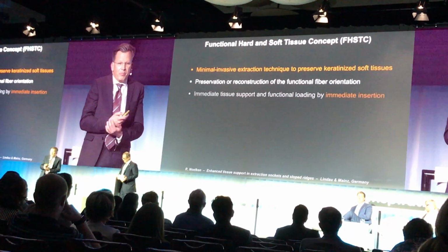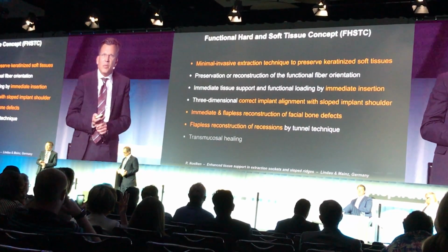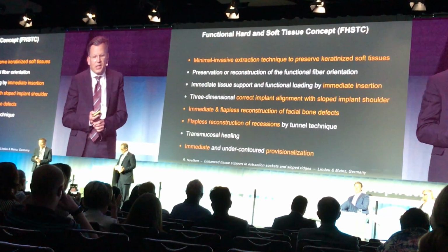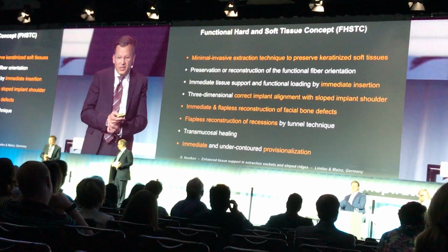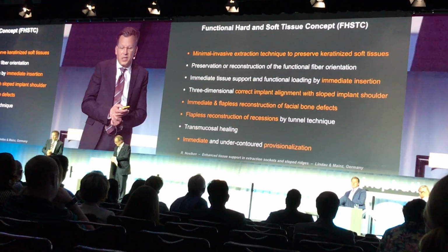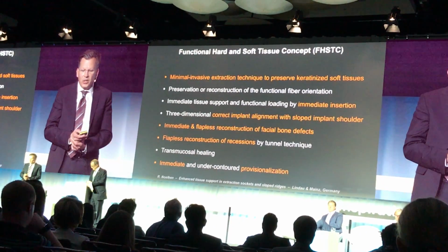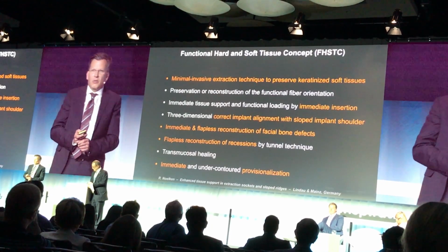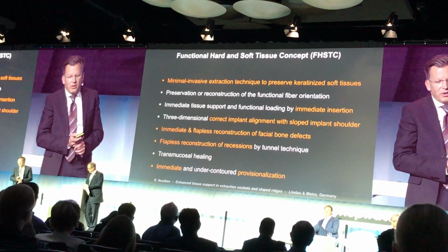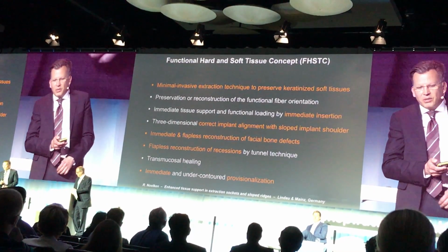The concept, what you have seen in the last 20 minutes, is based on minimal invasive extraction, the reconstruction of the functional fiber orientation, the immediate insertion of an implant in correct three-dimensional position, and the flapless and immediate reconstruction of hard and soft tissue defects, supported by an immediate provisionalization.